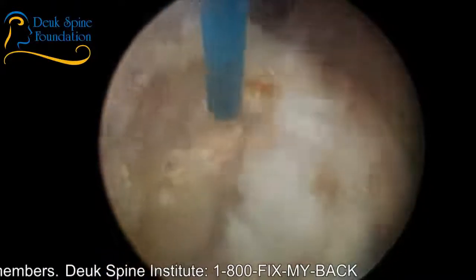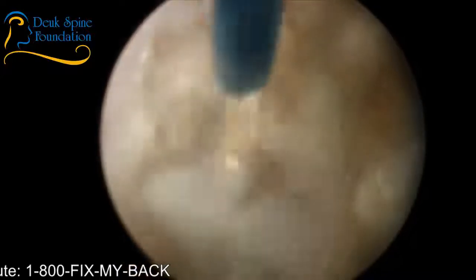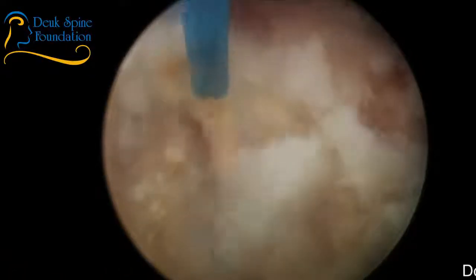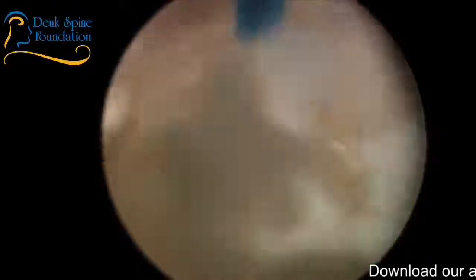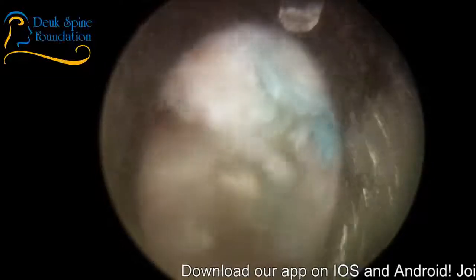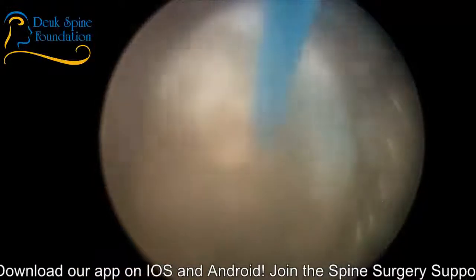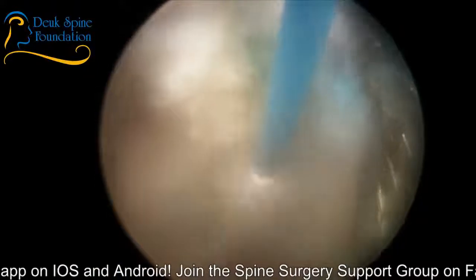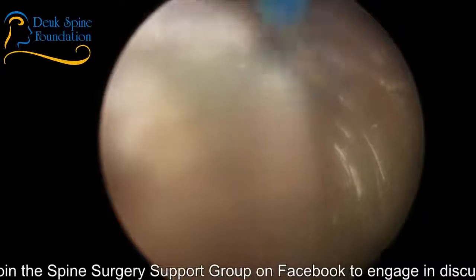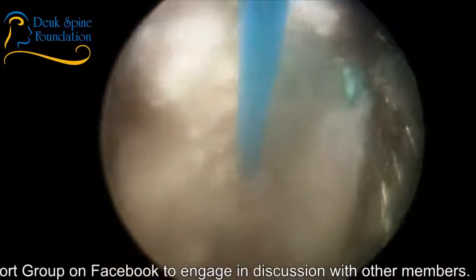The golden color you're seeing at the tip of the laser fiber is calcium. Basically, calcified scar tissue, meaning this is a long-standing problem. You don't get calcified scar tissue unless you have scar tissue for years and years and years. And inflammation is ongoing for years. It's called dystrophic calcification. Dystrophic calcification is basically calcification by your body of abnormal structures, abnormal tissue that's been damaged or injured. The calcification is not the problem. I'm just mentioning it for interest, so you can understand what's happening.